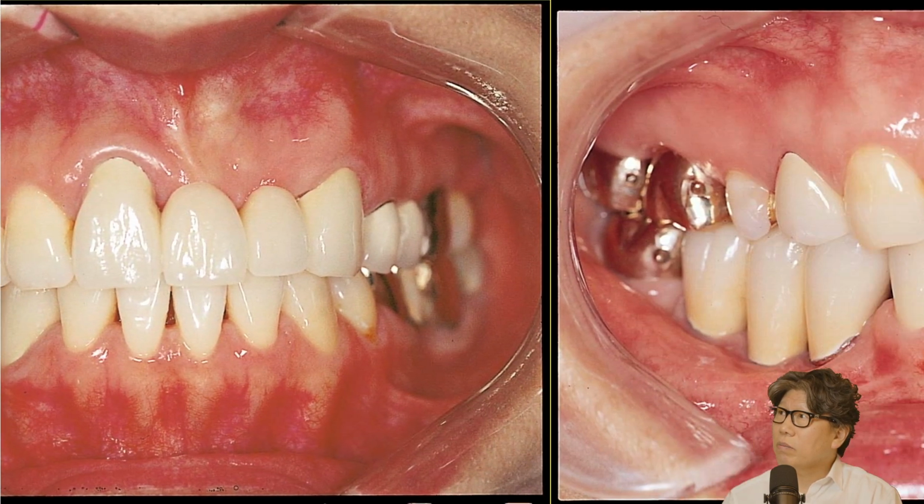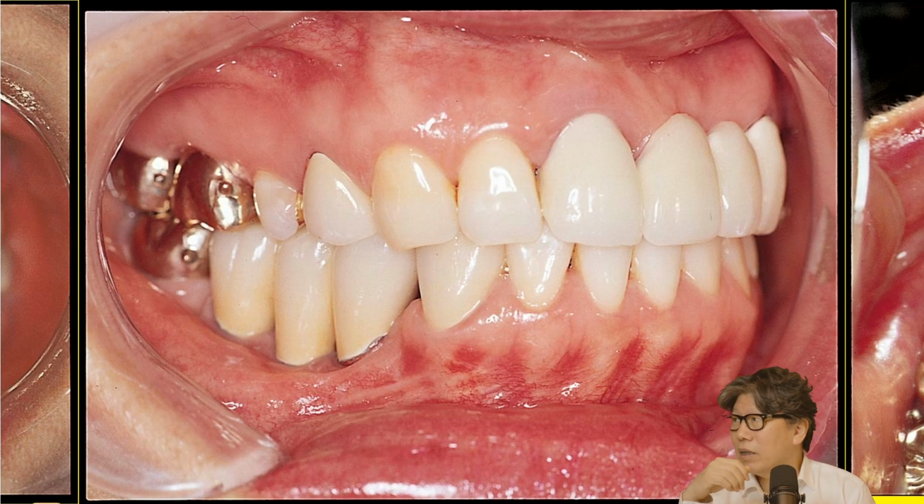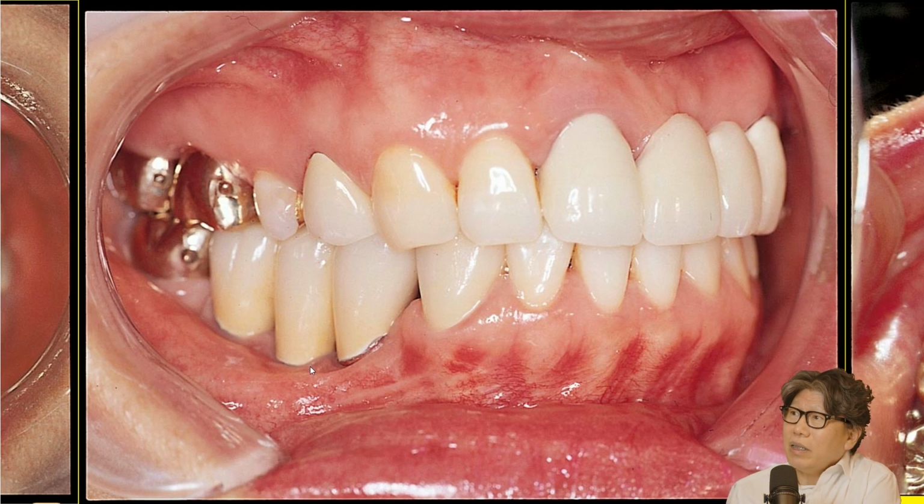So this is the final prosthesis now. We talk a lot about the attached gingiva. The muscle is attached here. What I mean by that is, if you do a bone graft, it's all gone. So now you can't have attached gingiva where there's a muscle attached. So most of the time, they'll put something on there to create an attached gingiva zone. You're doing CT grafts, and you're failing almost all of them, I think. No? It can leave scar tissue. But other than that, no.